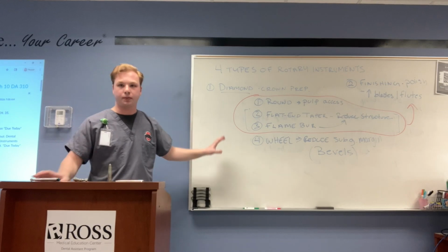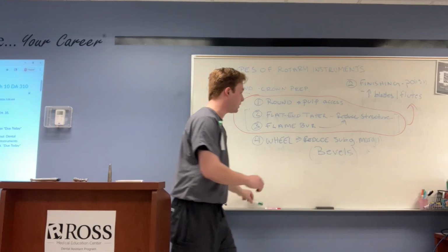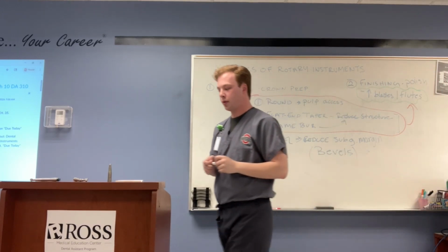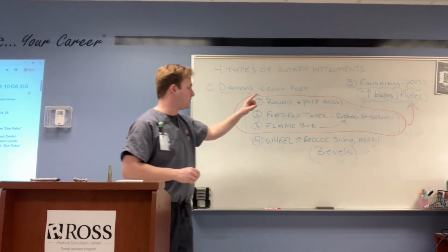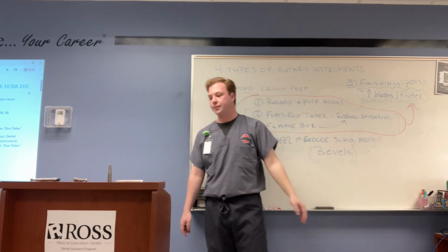Does all this make sense to everybody? Very similar, except the only thing that's different is there's an increased number of blades on that working end, or the head of the rotary instrument. This is the key part for the finishing burr. Okay.